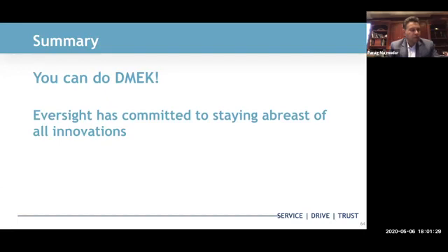Okay, so this has happened to me, of course, and it will probably happen to you too, but the chance of it happening with the DORC tube is much less because, as you saw on the video, how long that tube is. It's not short, so it can go all the way into the eye, and I like to put the tube into the eye over the pupil. If you watch, I can put it all the way into the eye and then insert the graft.